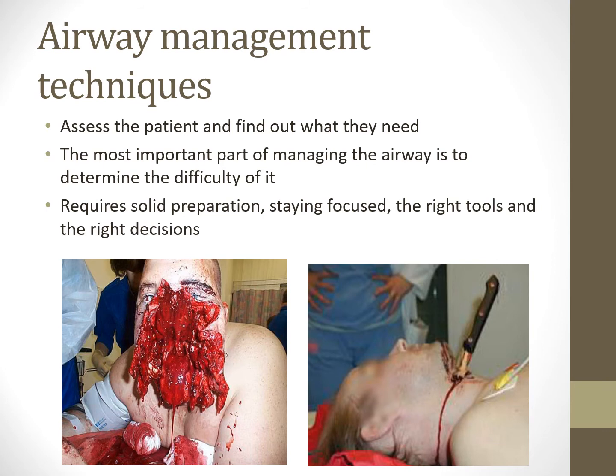So let's get started. When we're looking at airway management techniques, we need to look first of all at the patient and try to make sure that we provide them with what they need. Not with what we want them to have, but what they need. Does the patient lack the ability to maintain a patent airway? Does the patient lack the ability to protect their airway? Does the patient lack the ability to have proper ventilation but still can protect their airway, right? Is the patient semi-conscious? Is the patient fully unconscious? Is the patient fully aware? So we need to look at what type of airway tools and techniques we're going to have.